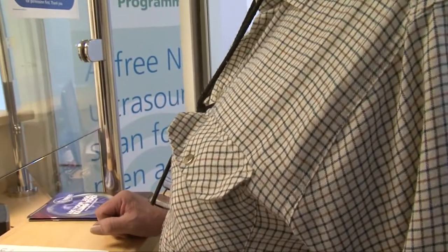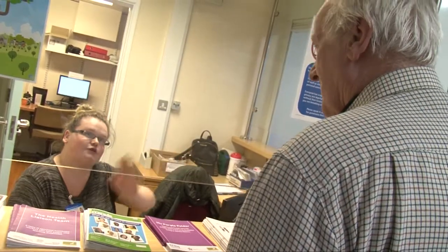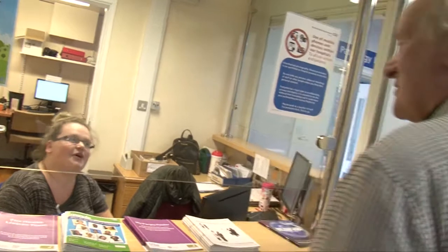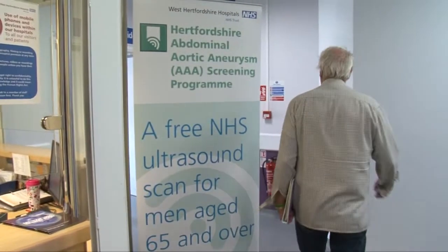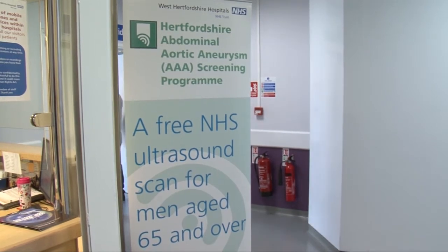Robert is over 65 and today is being screened for an aortic aneurysm. The aorta is the main artery that runs through your body. Arteries carry blood all over the body. Sometimes an artery can have a weakness, and this is called an aneurysm. Screening helps to find that weakness.